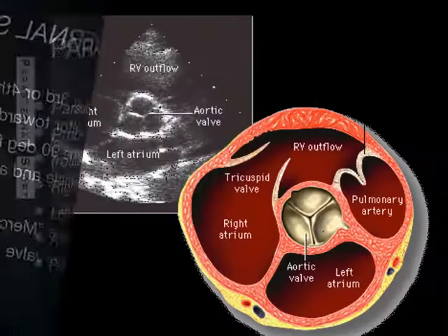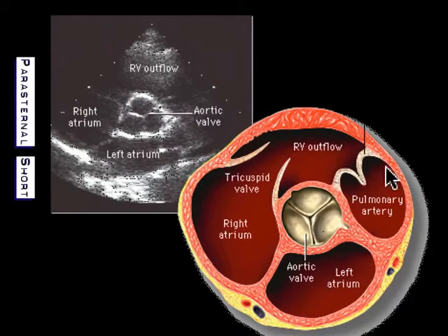Sometimes you can make out the pulmonary valve as well. This is a still image here of that Mercedes-Benz sign.